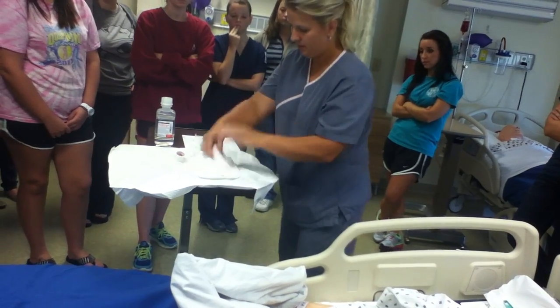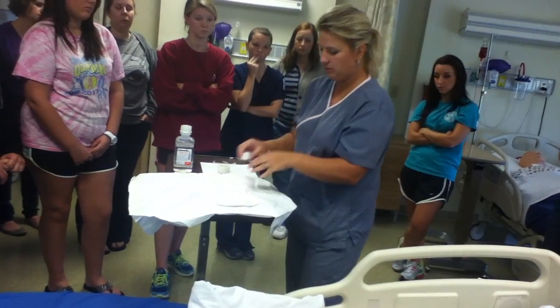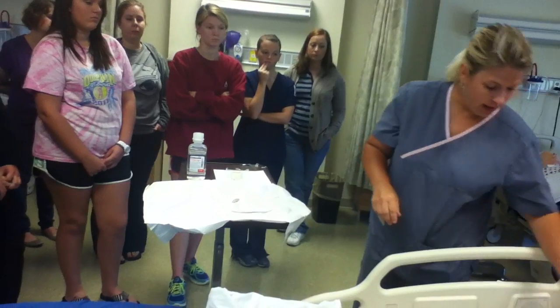Okay. And then you have the tape. This tape does not last long, so to be honest, it's going to run out real fast. That is all I would leave in there.